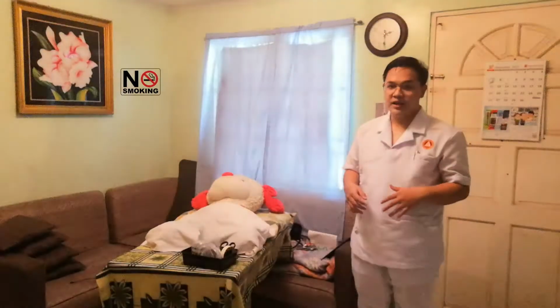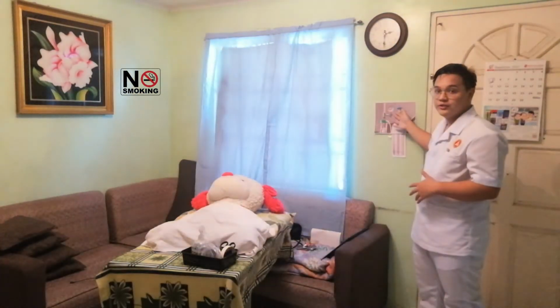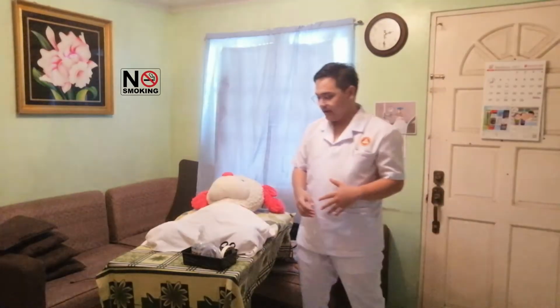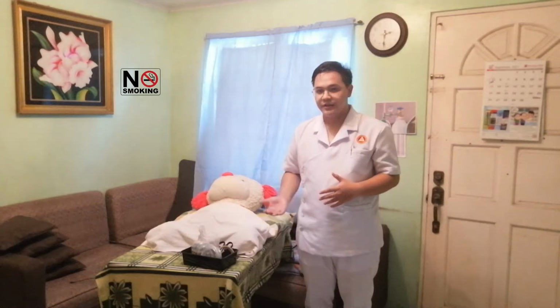So for the adapter and the flow meter and humidifier, you can see it here in our tank. Okay. And after that, we will now proceed to our next material, which is our optional material. We do need to have a tape. Okay. And now we will proceed to our implementation phase. So first thing that we need to do, we need to determine the need for the oxygen therapy, and we need to verify the order of the therapy.